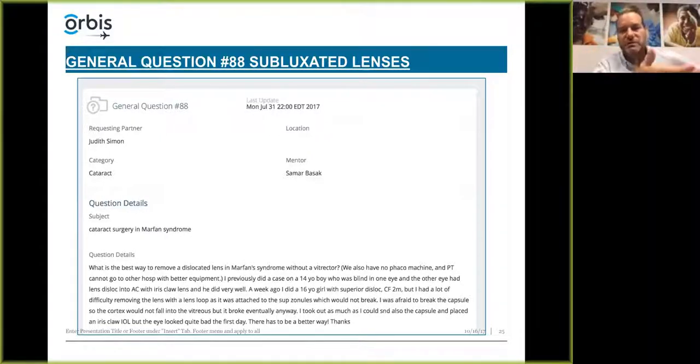If the posterior capsule breaks during implantation, if it's severe enough that you can't get that IOL in the bag, then you need to put that IOL, at least the haptics, in the sulcus. And that's one of the potential benefits of using a 3-piece IOL, which is why I'm doing these two questions together. That monoblock style IOL, like we just saw, those haptics are really thick, and you don't want those in the sulcus because they'll chafe the back of the iris and you'll get problems with inflammation and membranes. And so we don't put those in the sulcus.